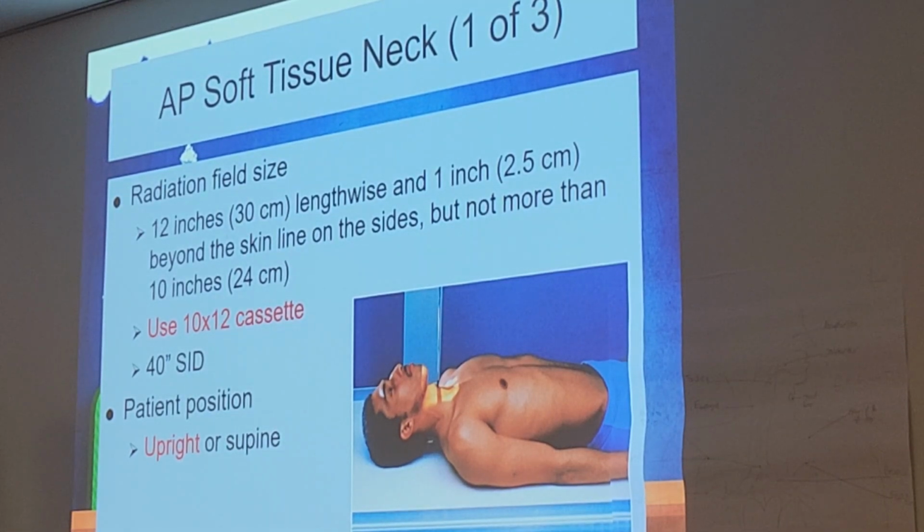OID. Now, patient position, patient can be laying down, but it's preferred they be standing upright. It's going to give you the better breath. It's going to give you the better image overall. So upright would be preferred for both your AP and your lateral soft tissue neck exams.